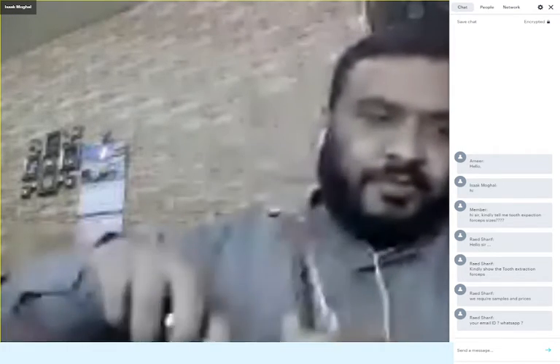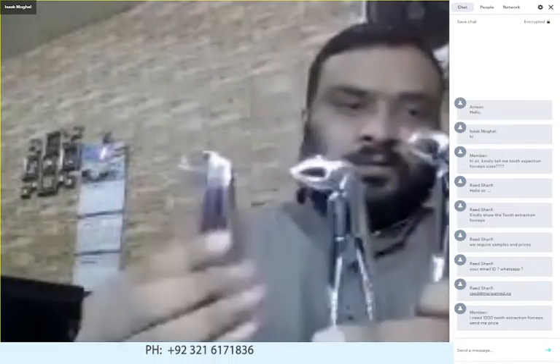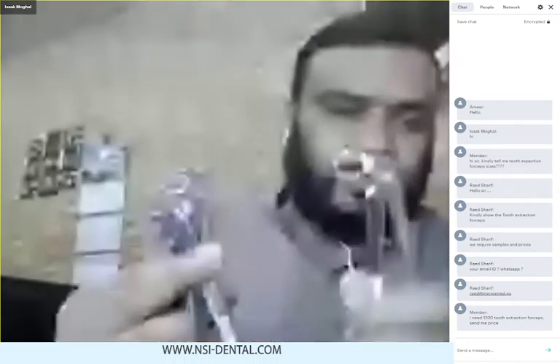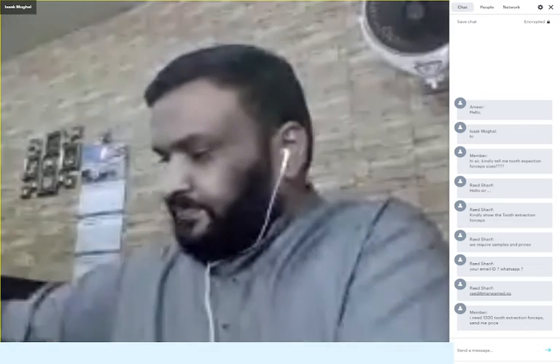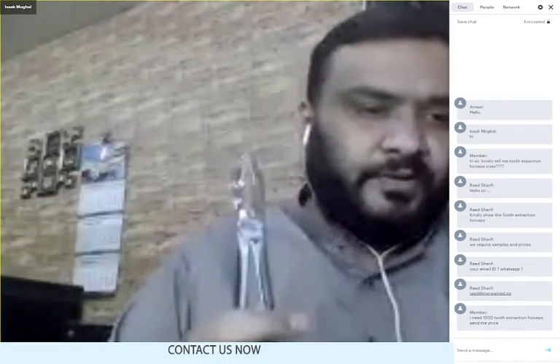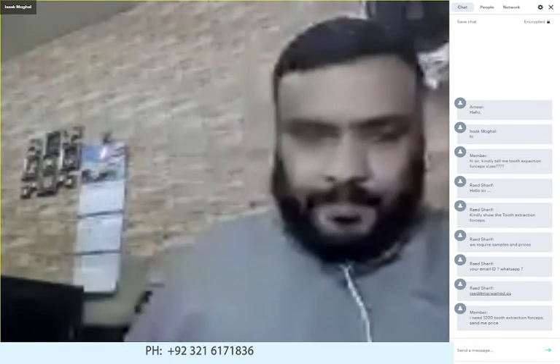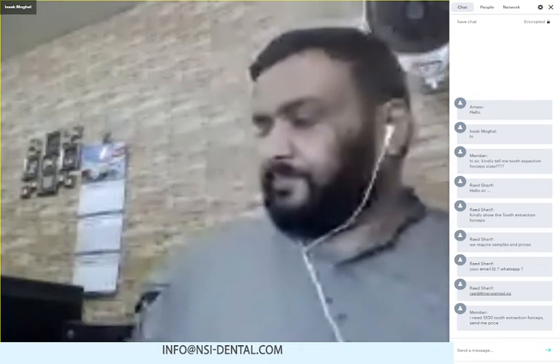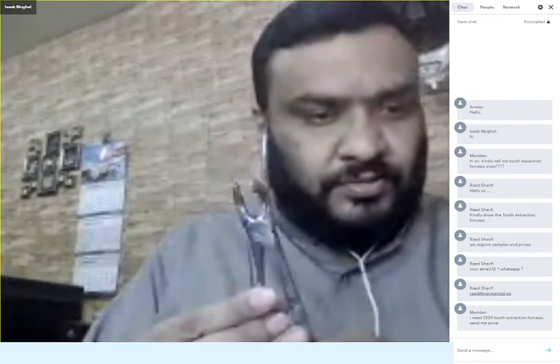In this set, there are three pieces for lower jaw tooth extractions. These three. This is for lower anterior, this is for lower premolars, and this is for molars. And this is for upper roots extraction. This is for lower roots, anterior roots, fixed 79, extraction forceps.